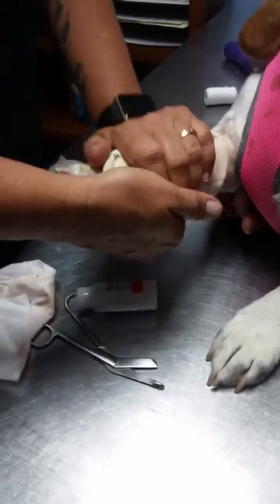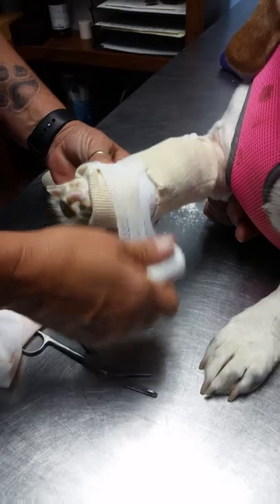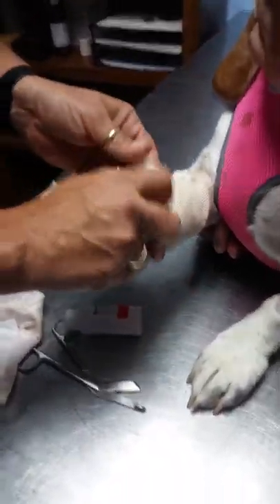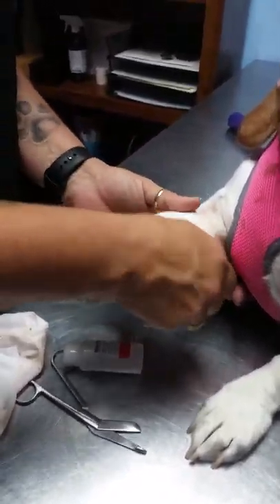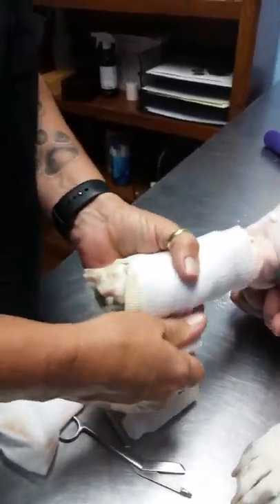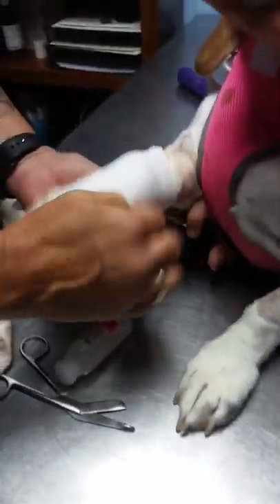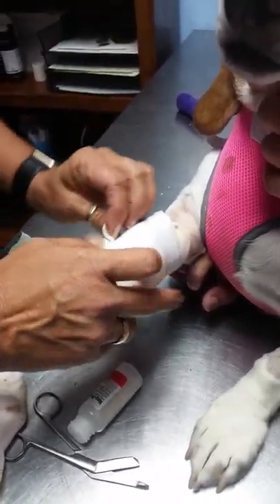You're almost done. She was quiet as a puppy — she was a runt. She looks big but if you see other bassets on the basset home page, she looks very, very little. Her nose is little and her ears aren't as long. When you put the stuff on, you kind of pull it snug but not too snug — just let it lay as you're applying the bandage.